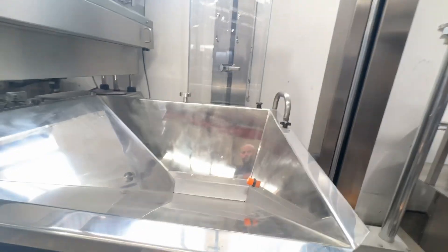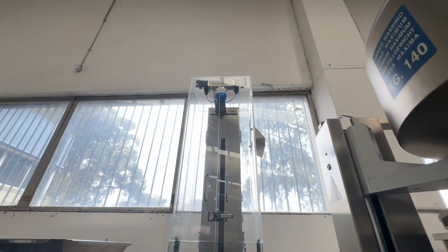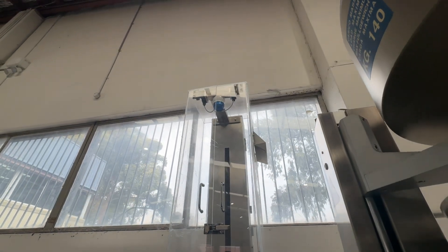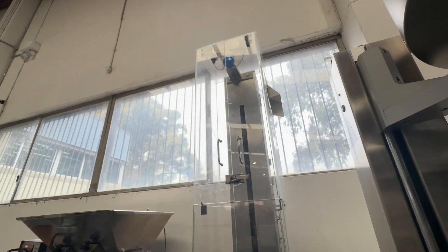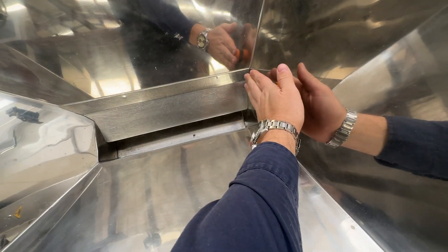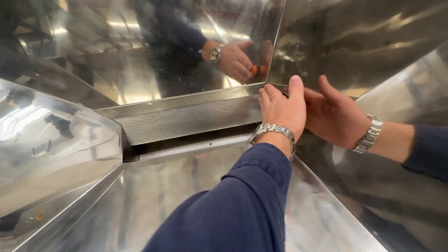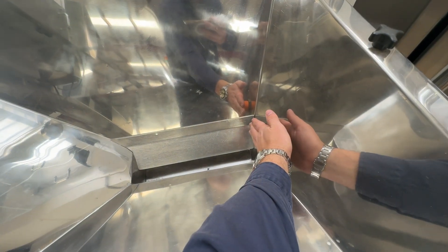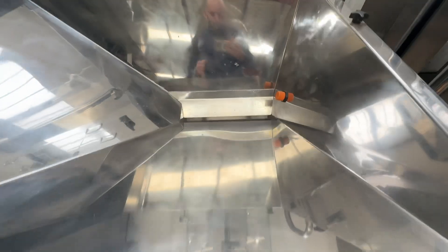It should not start, so the strobe — I don't know if the video is showing but that strobe is actually going off. There you go.